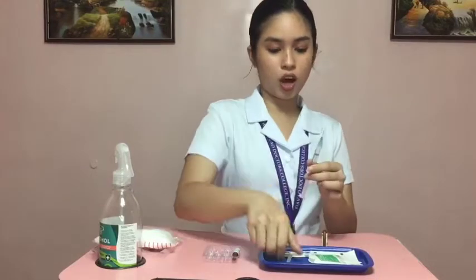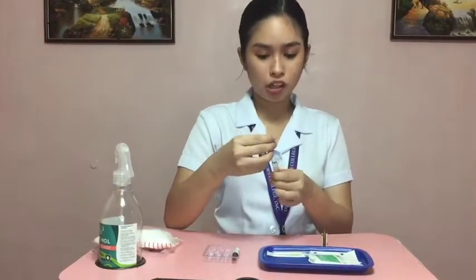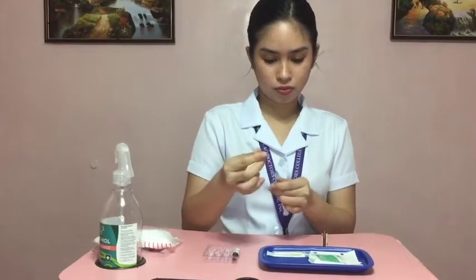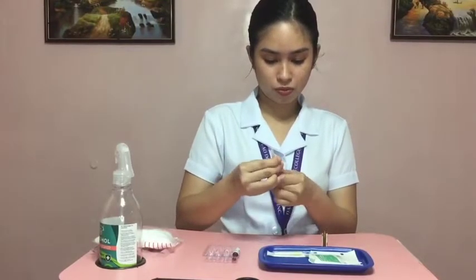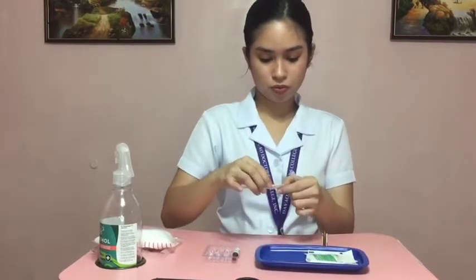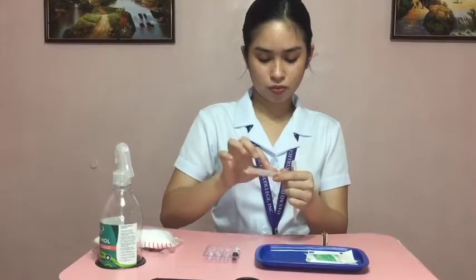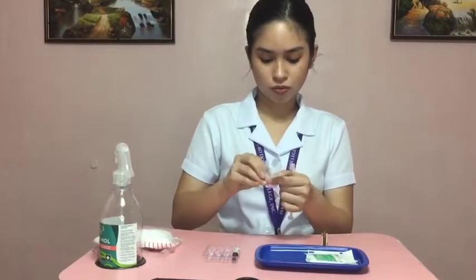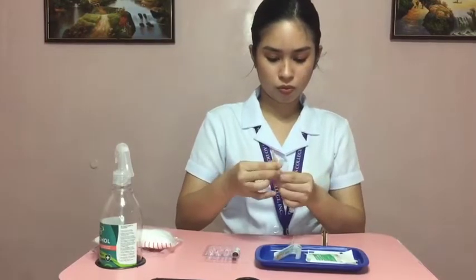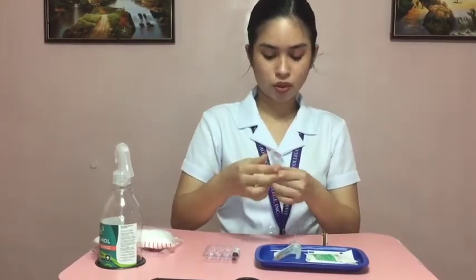Put the cap on the filter needle, then change the filter needle with the regular needle. Then now, let's proceed to our patient.